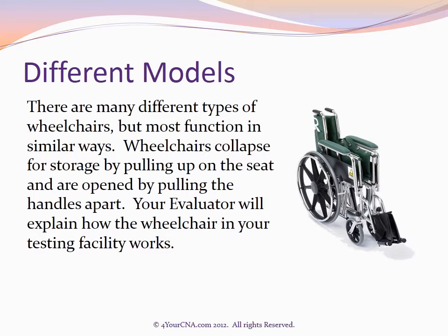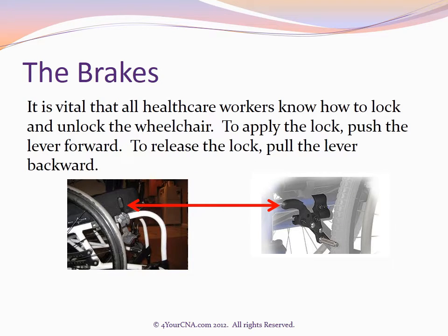Your evaluator will explain how the wheelchair in your testing facility works. It is vital that all healthcare workers know how to lock and unlock the wheelchair. To apply the lock, push the lever forward. To release the lock, pull the lever backward.